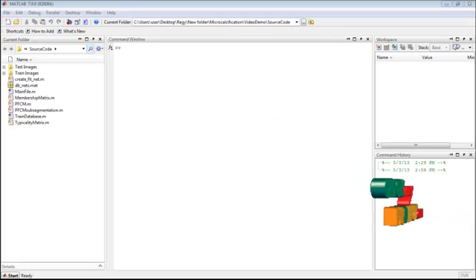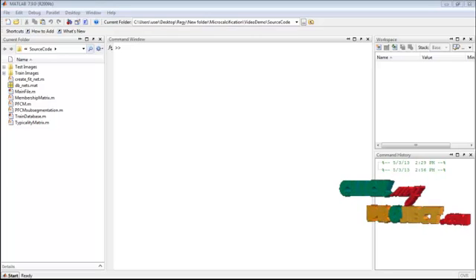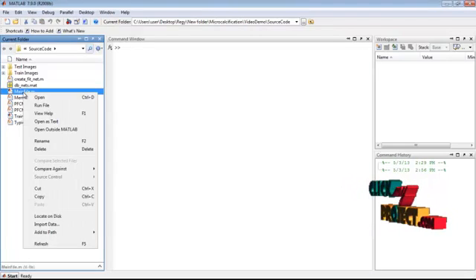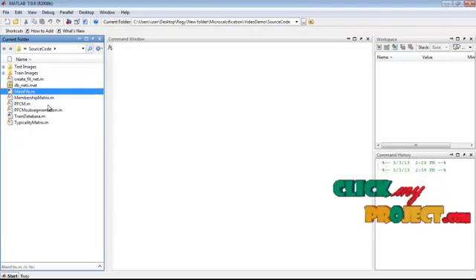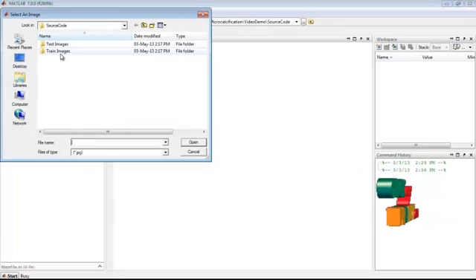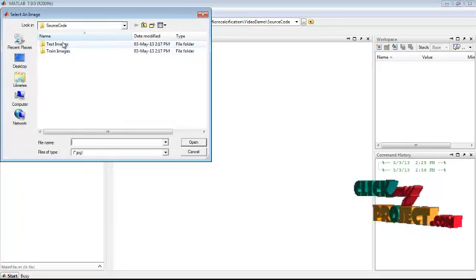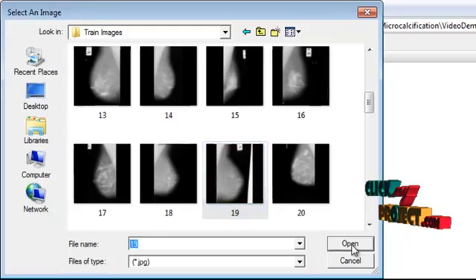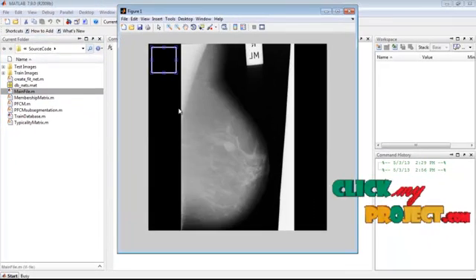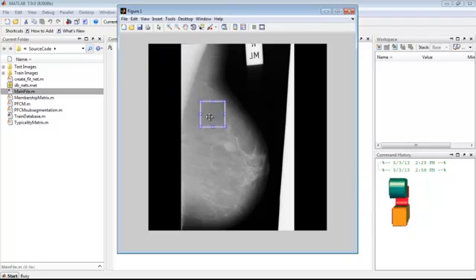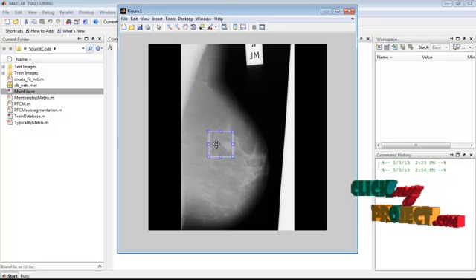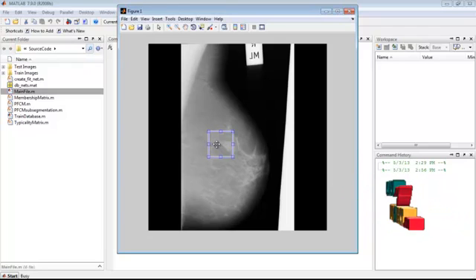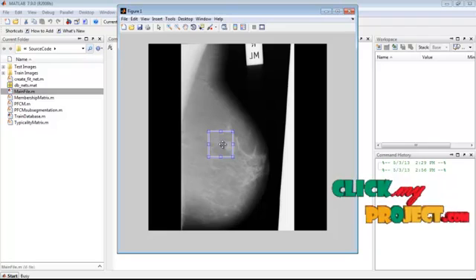Now we'll see the demo of this project. To execute, right-click on the main file (.m) from the source code folder and select 'Run File'. Select any image from any of the folders and click the open button. Then drag the window to the region where you want to detect micro calcium deposits and double-click on the window.